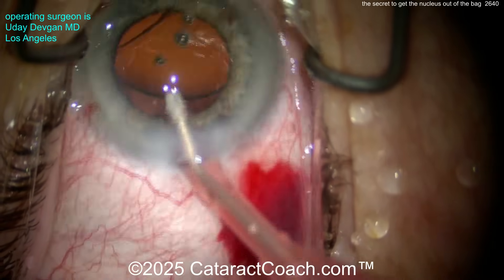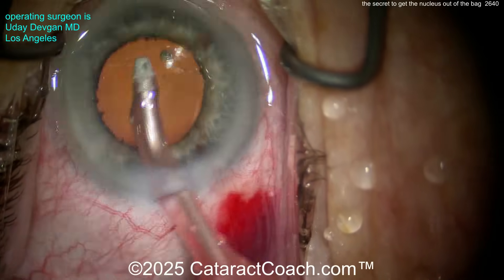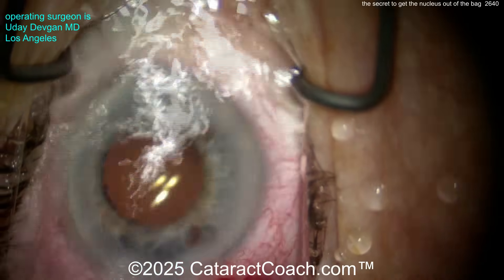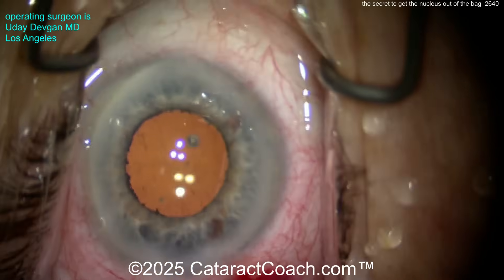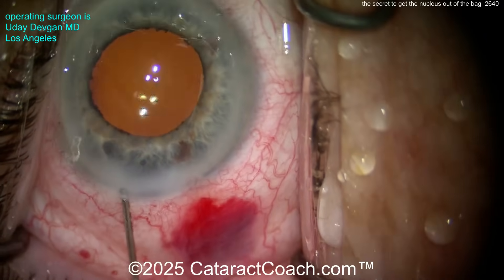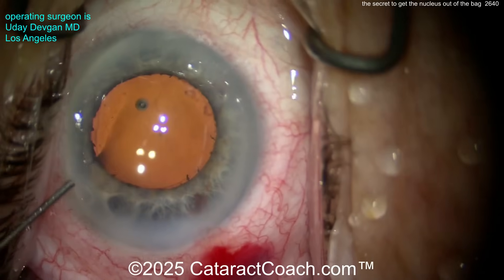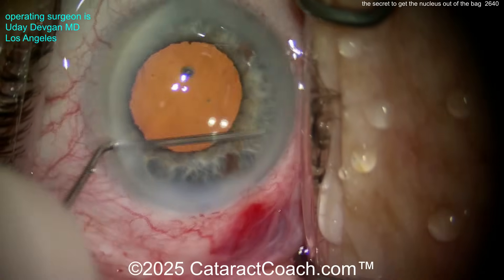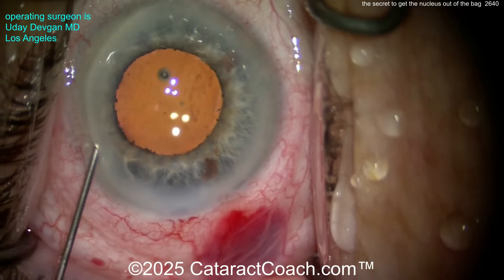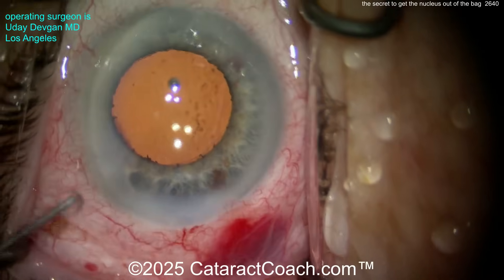Very nicely done. If you want to try this technique, I think it works really well and it's really gentle to the iris. There are no marks from a pupil expansion ring, no iris hook marks, no extra incisions, and it's very efficient — this case is barely six minutes. Our goal is efficiency, not speed. If it's my eye, please spend an extra minute to make it perfect. Sealing up those incisions — those look great. A little sweep with BSS to get out the last bits of viscoelastic. Lens looks great behind the rhexis 360. Let's call this done. Beautifully done — I'm happy for the patient and the patient's happy too.